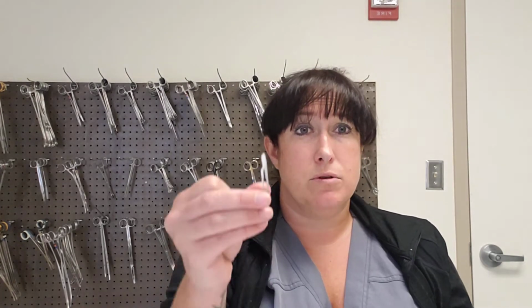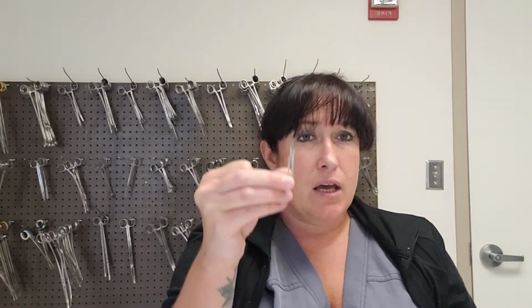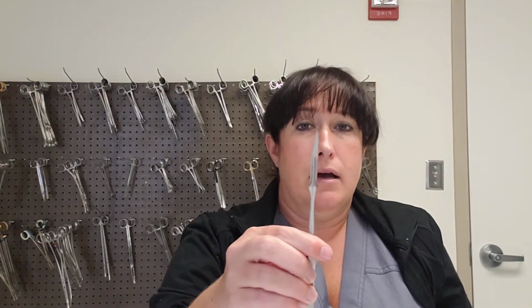When would you use this? We've got a couple different answers for you. Anytime you're doing a laparoscopic procedure, they're going to put in these things called trocars, and you don't need a big incision for these trocars. In fact, that's part of the benefits of laparoscopic surgery. And many surgeons will use this point to make their little incisions for their trocars. I have worked with a surgeon, or actually a couple different ones, that will use the 15 blade instead of the 11. Either way's fine. Do what your surgeon wants. But I'd say that the 11 blade is actually more common.